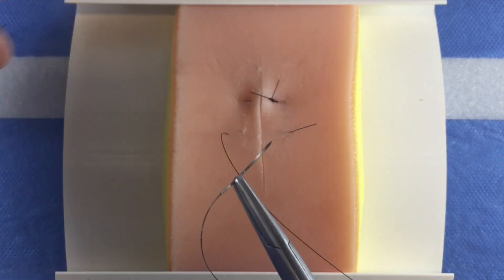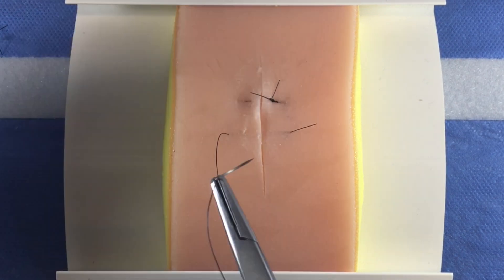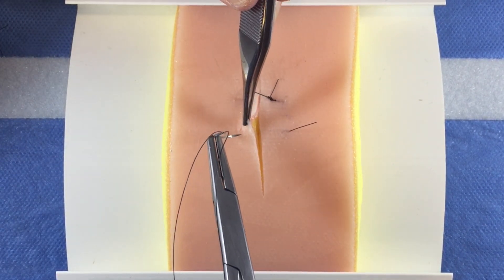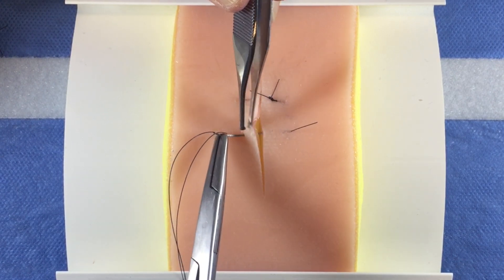Load your needle backhand. Note, you may be able to do this forehand by repositioning your body. Grasp the skin edge on the side you just exited.